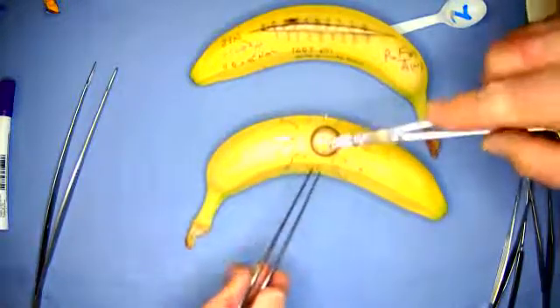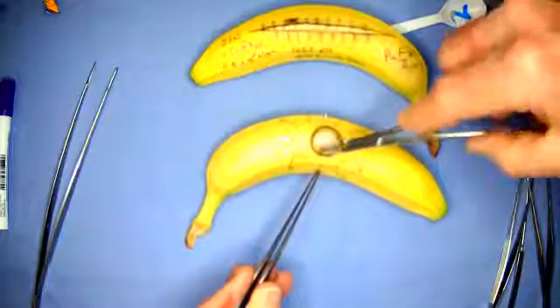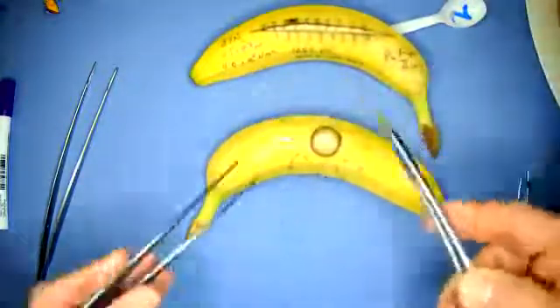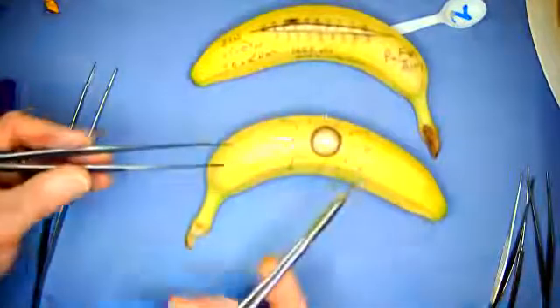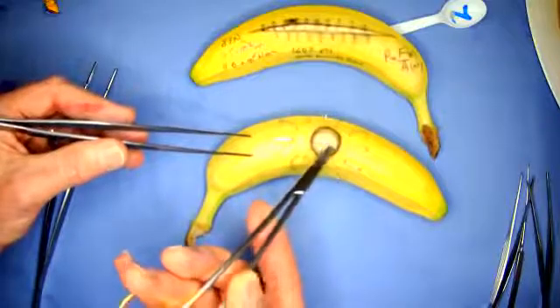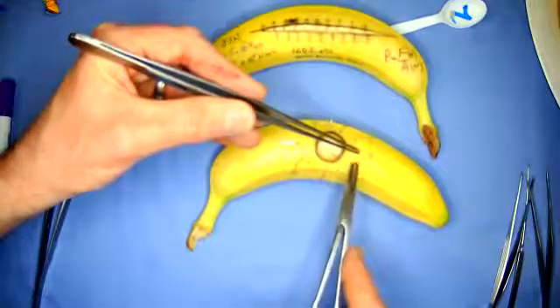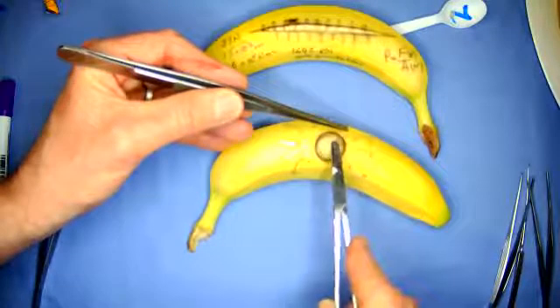So I would like you to practice now combining your needle skills as we've discussed, once you've mastered them. Oopsie, just dropped out of my needle holder there after a lovely backhand switch. I'm going to hold that one there, pretending I'm holding the tissue and delivering the needle out. And I'll move around and do the same.